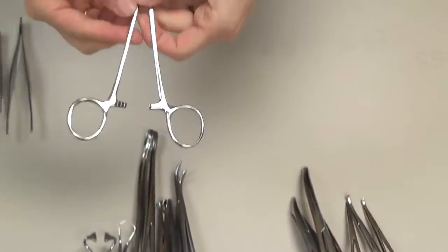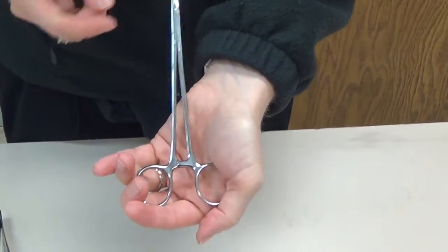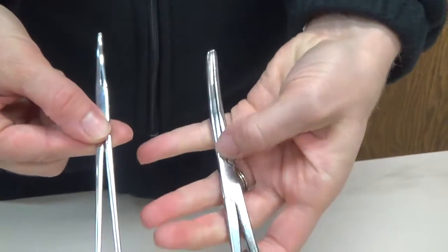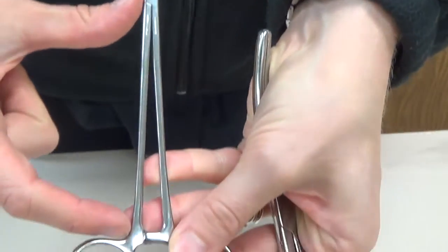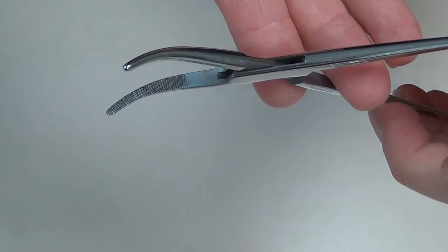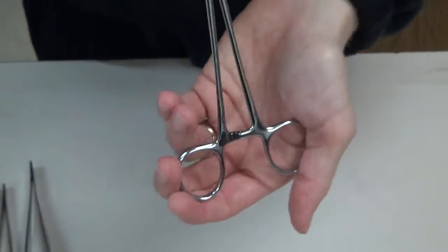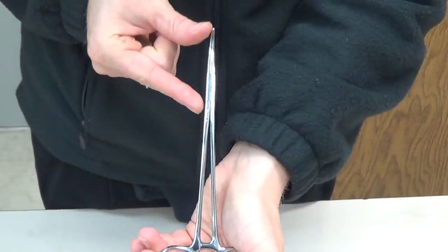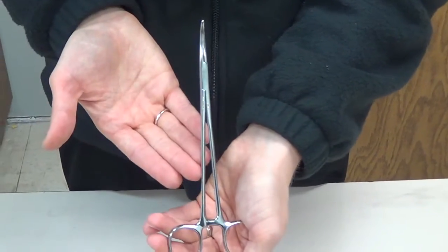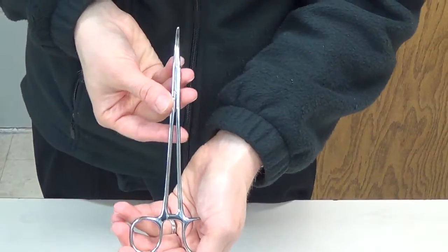Another specific hemostat is what we refer to as an Adson tonsil clamp. You can see the shape is a little different — it's very fine with a very long shaft and very short tips compared to, say, the Carmalt. The serrations only go partway down, so some people refer to it as a long Kelly. We use this when we need fine dissection in a narrow area, such as deep in the throat on a tonsil — which is why it's called an Adson tonsil. Some surgeons also prefer it for fine dissection in tight areas of the abdomen.